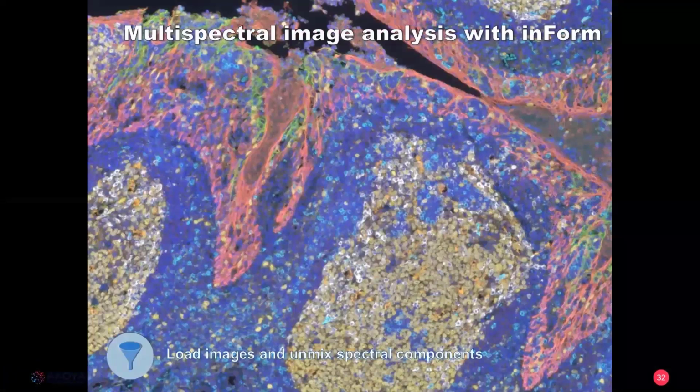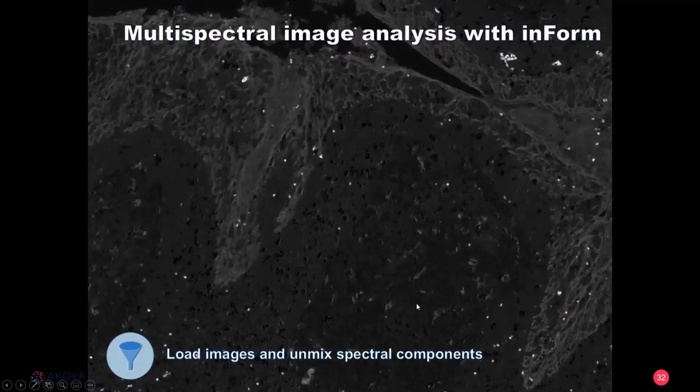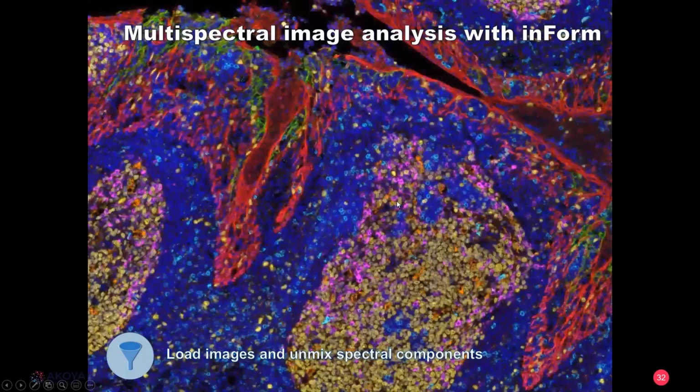So Inform is our image analysis software, and it has 5 main functions. The first function is unmixing, and that's what we're looking at here. What we see here is a raw image right when it comes off of the Polaris. This image shows just the contribution from autofluorescence. So this is after unmixing. All of this autofluorescent signal is isolated and pulled out of the image. And then this is the unmixed image.